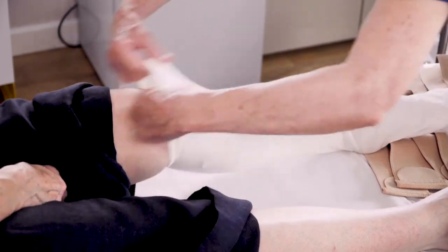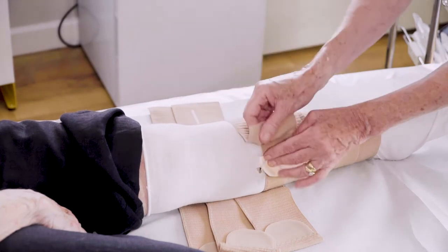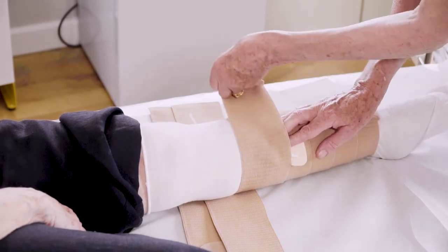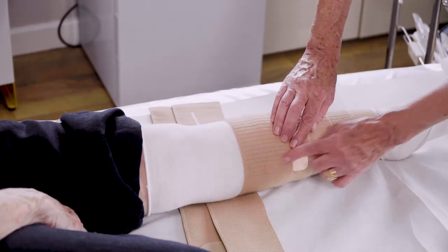You are now ready to apply the compression wrap. First, protect the area under the electrode wires with a simple foam adhesive dressing to avoid any pressure injuries. Then, follow the manufacturer instructions for applying the wrap and feed the wire between the overlap straps.